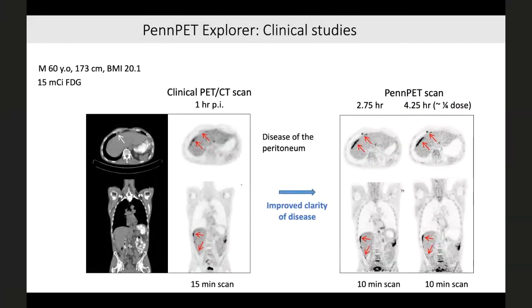And Rose, I was just going to follow up with what you said. There's a couple of ways of playing this. One is to be able to take better images, especially dynamic images at standard dosing. The other thing is these days there's been some improvement in the technology of the CT so that the radiation dose actually now again comes substantially from the emission portion. That wasn't always true. So if you have a subject needing a number of scans, then you always have the option, if the radiation dose is the rate limiting process, this scanner is going to allow you to go at quite low radiation doses, and this has pediatricians quite excited because it may provide a situation for a variety of reasons to really reduce dose and risk for pediatric patients.